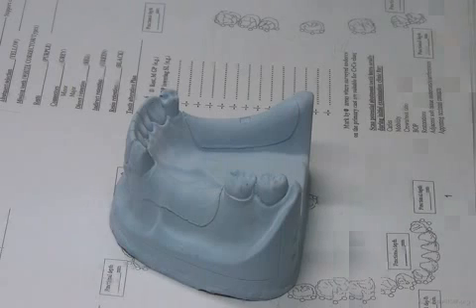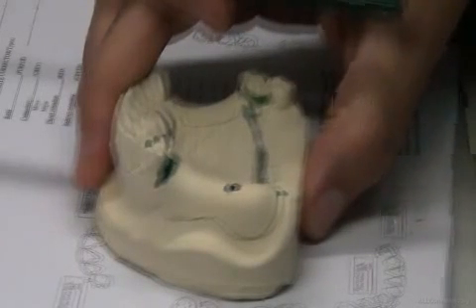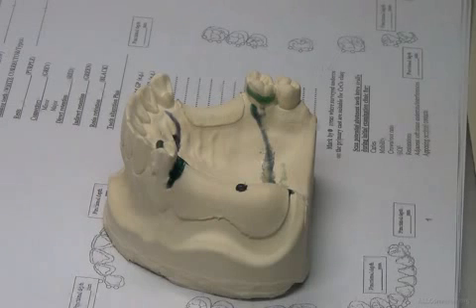The upper, what is the best major connector? The palatal strap. This is the best. Okay? We get the best support. It's the thinnest that we could produce, because it's large, I could thin it, the metal is still strong, even if I make it thin. I could mimic the palate. I'm away from the gingival margins of teeth. So, let's say this is the very basic design.